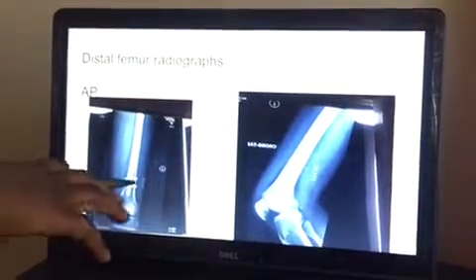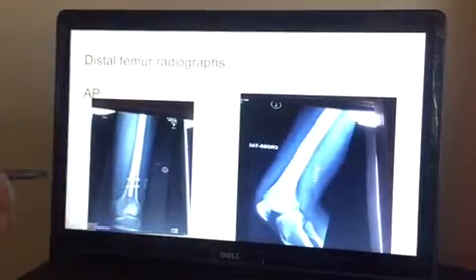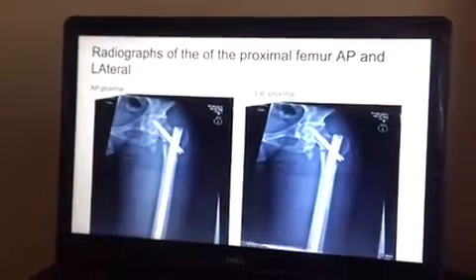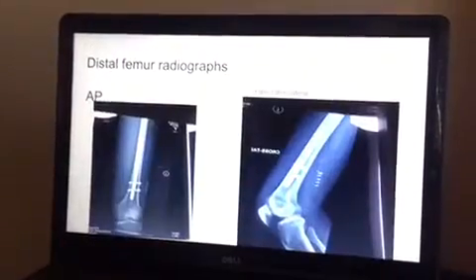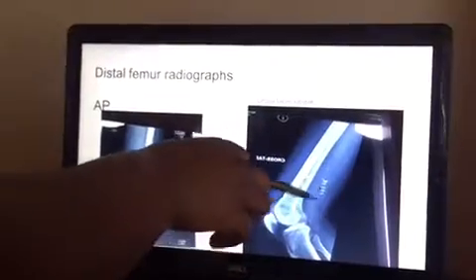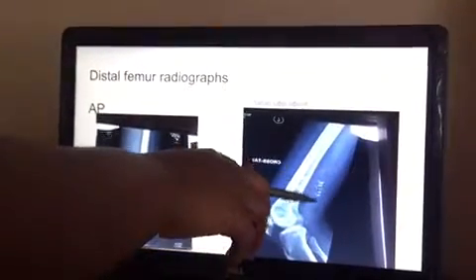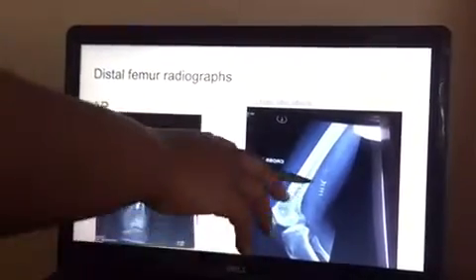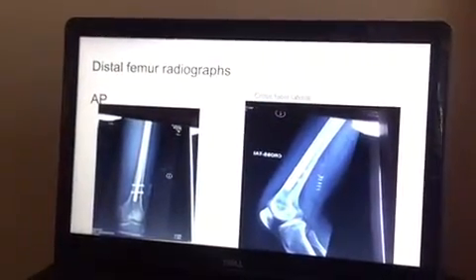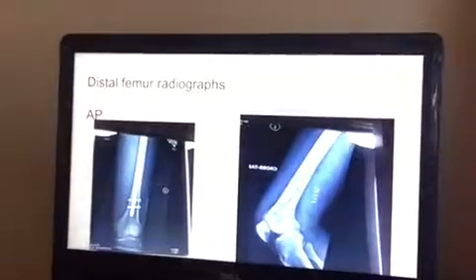These are the screws just to hold the implant stable. These are other screws, and these. So as you can see, these are the openings. The stitches they did are still there, so that shows how new this case was.